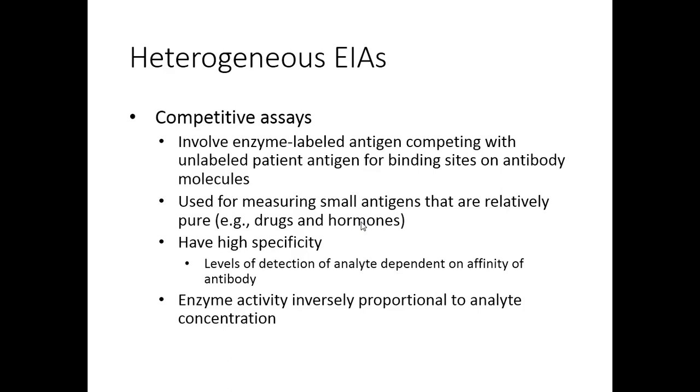And we know with all competitive assays, they're what? Inversely proportional. We know that for sure. What does that mean? The more patient antigen that gets bound, the less enzyme-labeled antigen can be there, so we have less signal change. So one's high, one's low.